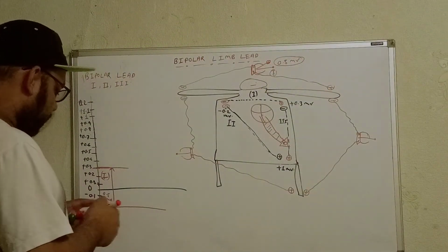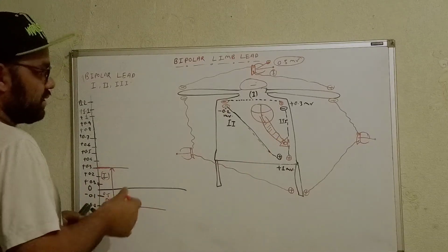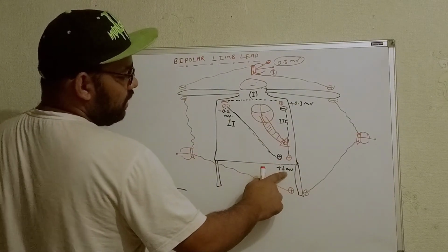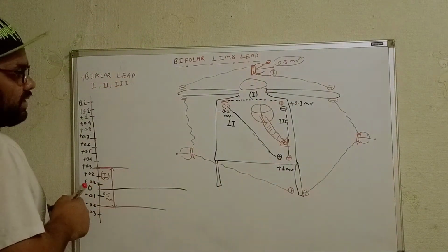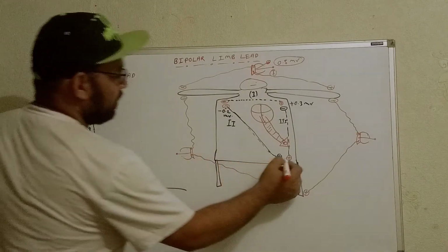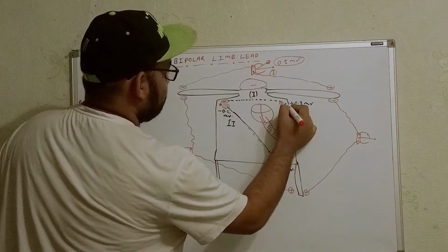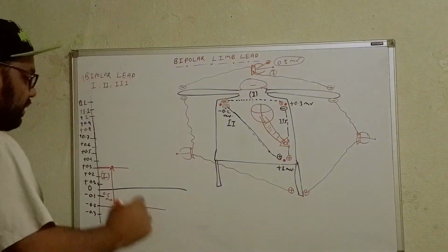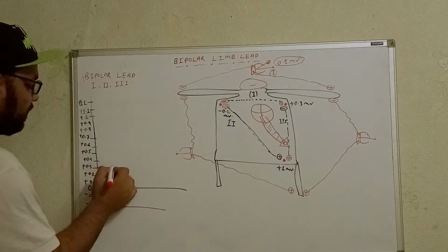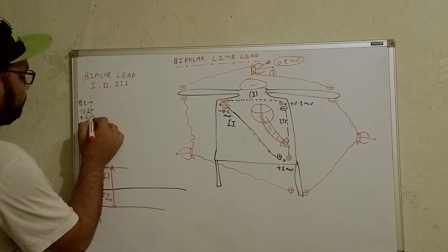Now in terms of lead number 2, let's talk first about lead number 3. Okay, now for lead number 3, what is the potential over 0? Plus 0.3 and plus, how much is over here? Plus 1. So plus 1 and plus 0.3. Now see, where is 0.3? 0.3 is over here. Let's make the electrodes this way, and it will be easier to identify them. Okay, now see. Now we are getting plus 0.3. Now plus 0.3 is over here, and we have to go up to how much? Plus 1. So where is plus 1? Definitely the plus 1 is over here.